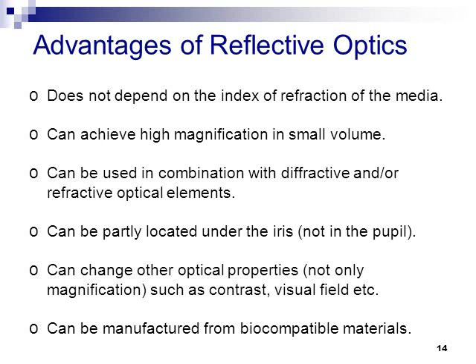What is the advantage of a mirror telescope as compared with a regular refractive telescope? The magnification of a Galilean telescope depends on the difference in the index of refraction between the different media that the light passes through. That is why the IMT is so long, 4.6 millimeters. By creating a telescope using mirrors, we do not depend on the index of refraction of the media, but mainly on the curvature and positioning of the mirrors. That, by the way, is why astronomical telescopes, such as the Hubble, are all mirror telescopes.